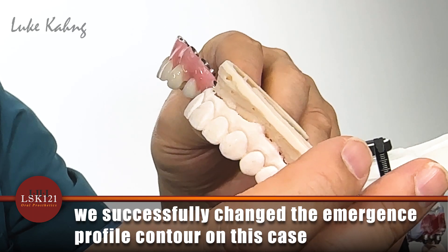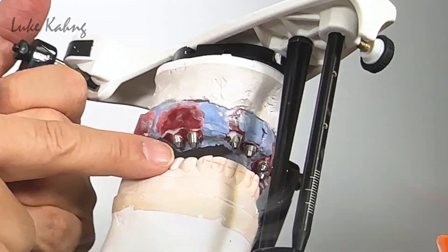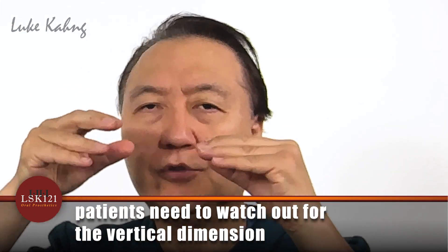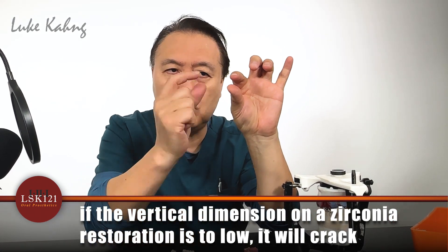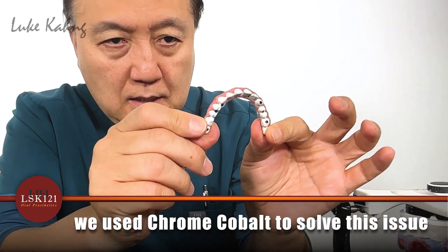We lower the vertical dimension a little bit, and patients have to watch out for vertical dimension. It means from this side — the tooth is getting smaller. When we get old everything collapses and gets ground down. If vertical dimension is too low — meaning teeth are too small — the zirconia full mouth restoration can easily crack and the Ti-base can fail. So we made a chrome cobalt, which is top of the line.